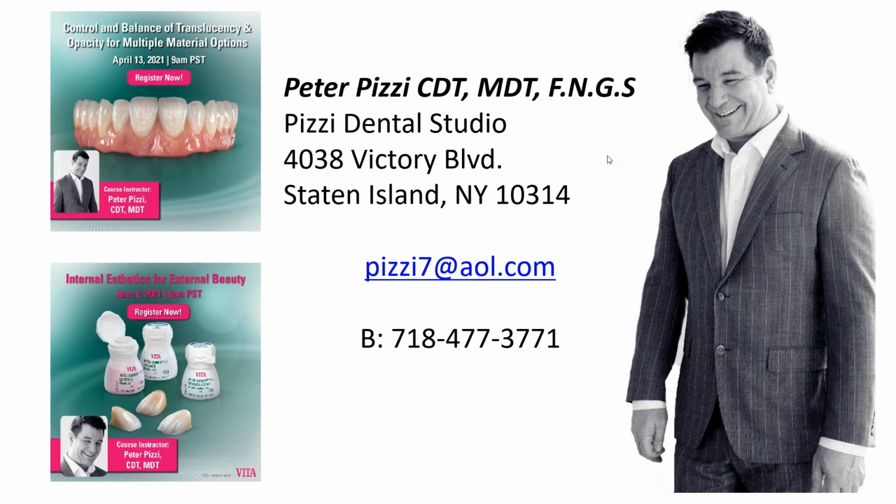And then the other side, it also gives you value, right? As a technician, it gives you value for the doctors and the clinicians to understand what you do for them. And then the second part of that is those basic photographs are just basic diagnostic tools. If I need more shade taking, polarized photographs, then it's a little bit more involved.